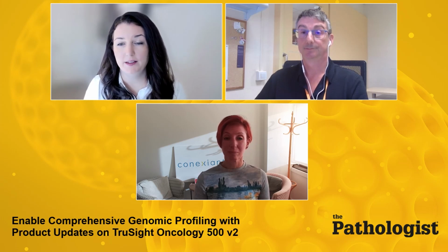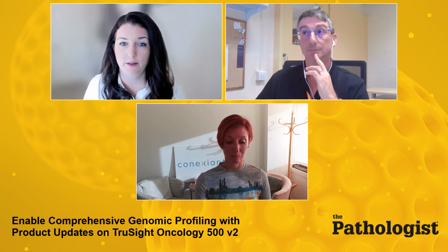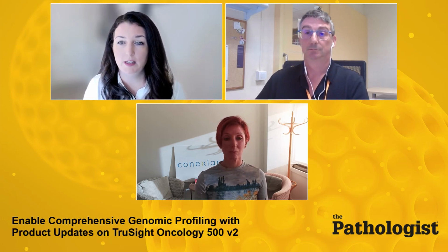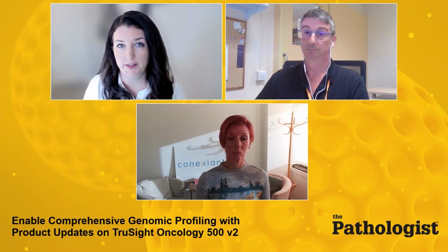Yes, thank you, Helen. So the median exon coverage is the coverage across the panel. That's a metric that's in our sample QC report. And so with the V2 assay, we've made several changes to reagents and chemistry and done a lot of overall optimization to the workflow. And that has improved our library conversion efficiency.